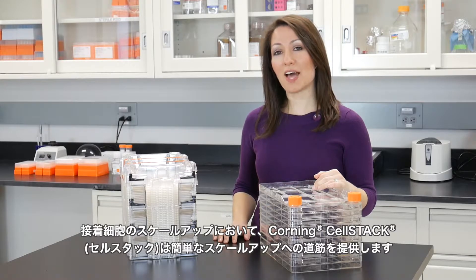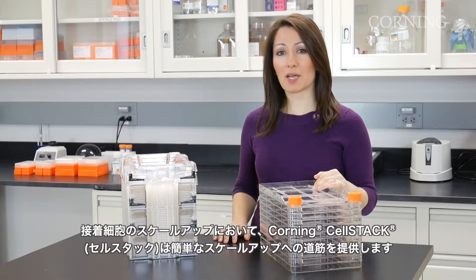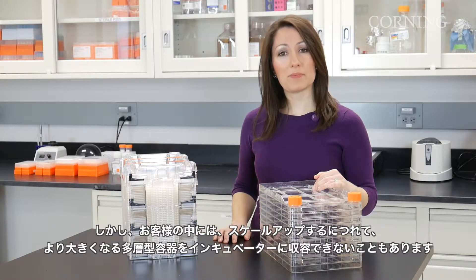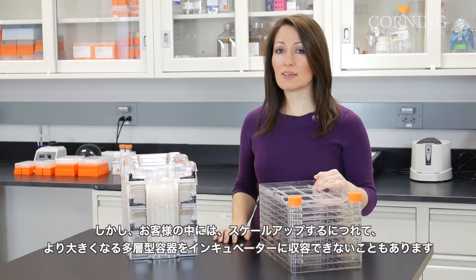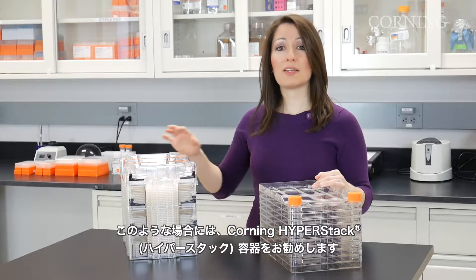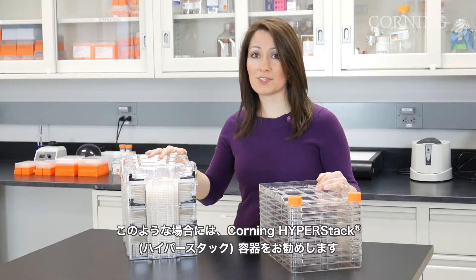For scaling up adherent cells, Corning Cell Stack provides a straightforward scale-up path. However, some of our customers can't accommodate larger stacked vessels as they scale up. In these cases, we recommend the Corning HyperStack Vessel.